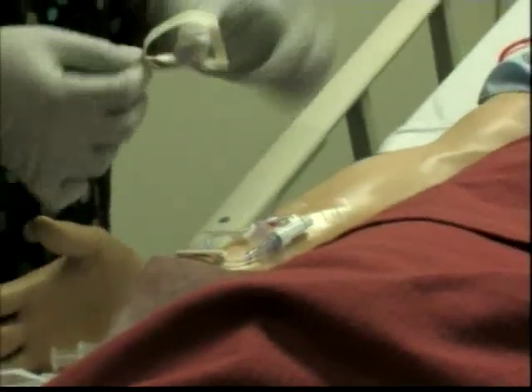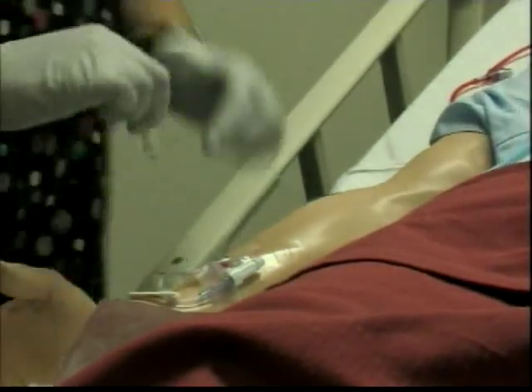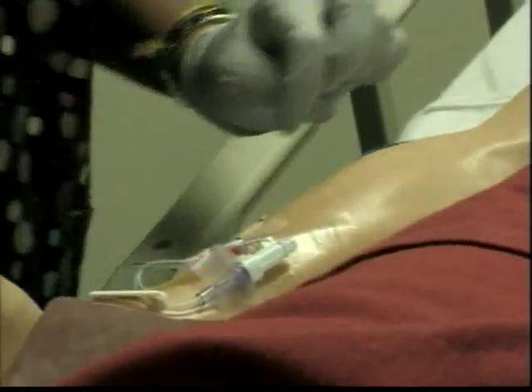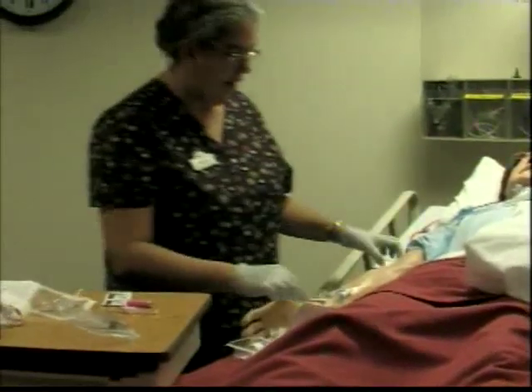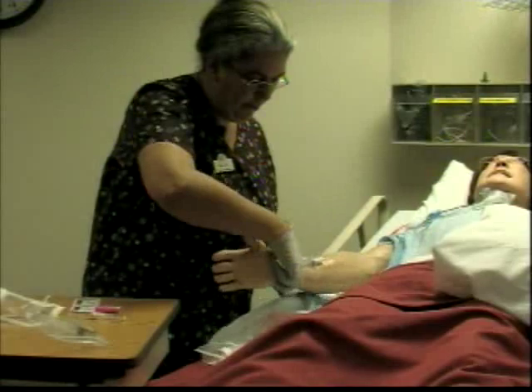Remember that you have this part in here where you will put your date, time, and initials, and you're going to put it in a place where it's away from the site. You want to make sure that you take this to the sharps container, and that you have cleaned every area, all the things that you have in here.